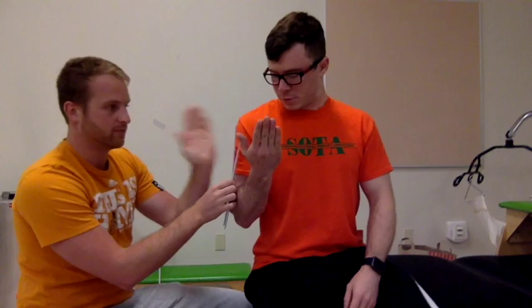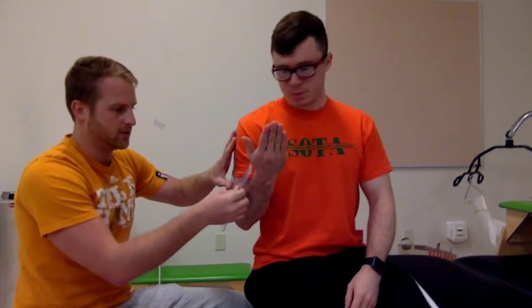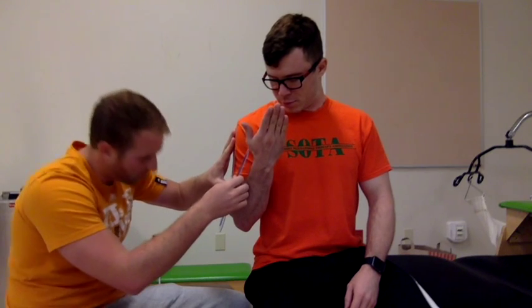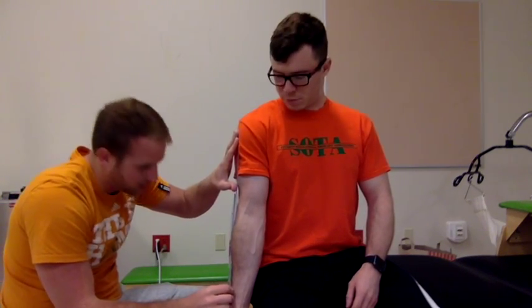This is elbow extension. We find the lateral epicondyle as the axis point, and then we line up with the trunk of the body, or the humerus. And then the moving arm goes with the forearm. We start at 135 degrees, extend for me, and we get to 20 degrees.